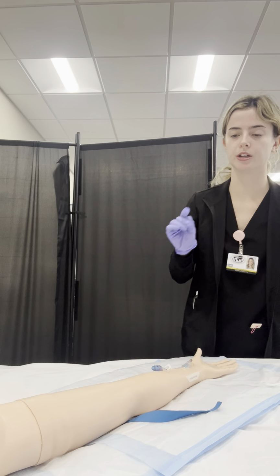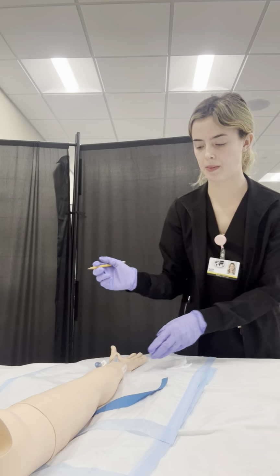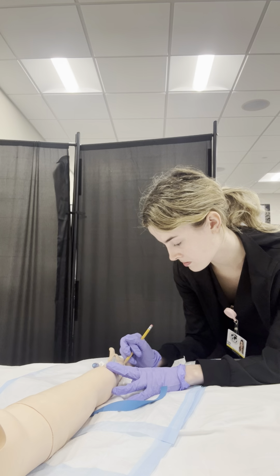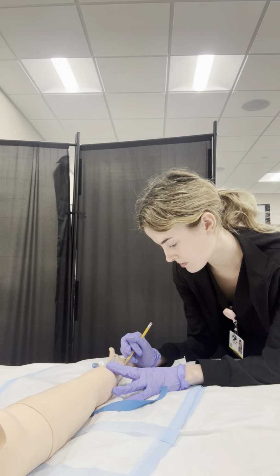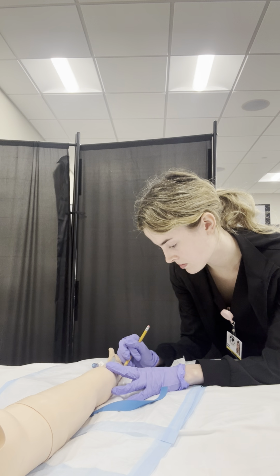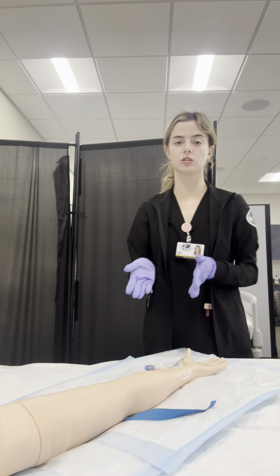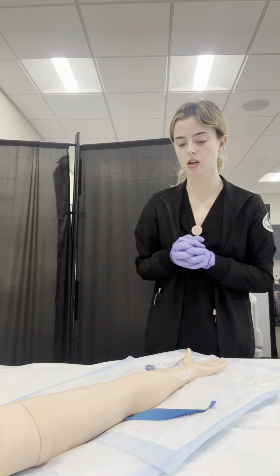And then I would write the gauge, the date, the time, and my initials. So the IV is labeled with the gauge, date, time, initials.